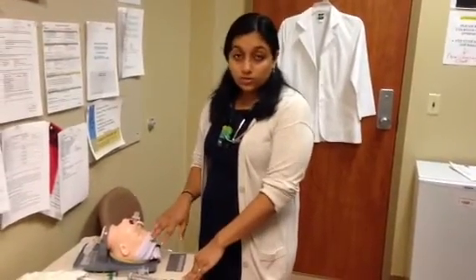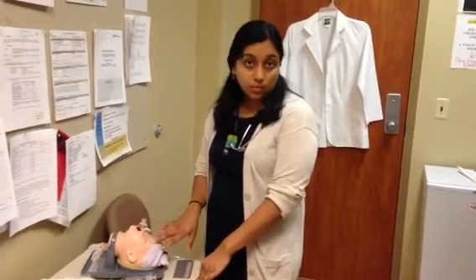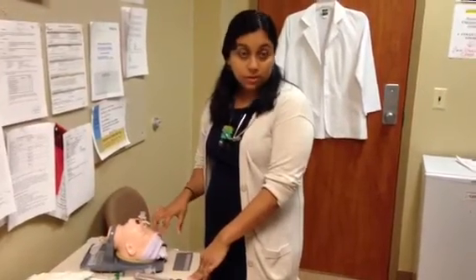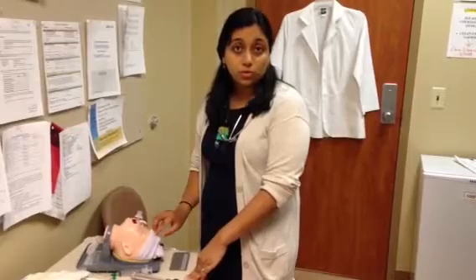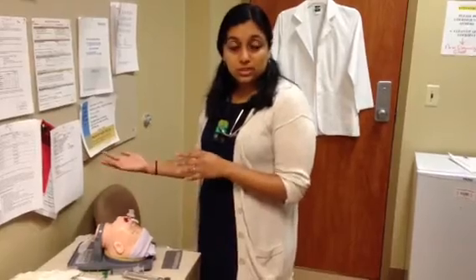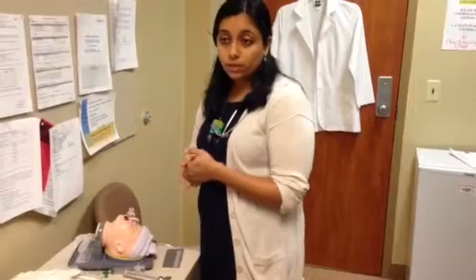So this administration does require 2 people. There will always be a physician present who can help administer the surfactant, and we'll make that part of our policy. If the infant is ill enough to need surfactant, there should always be a physician present. And between the physician and the respiratory therapist, there should be enough hands to be able to do this, leaving the nursing staff to be able to care for the rest of the infant, checking labs, placing IVs, things like that.